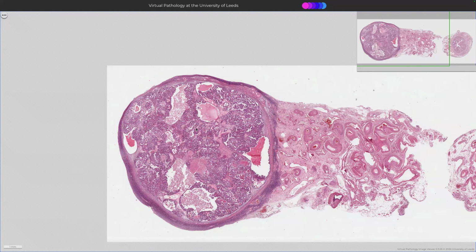The napsin A could be replaced by another one that begins with H that I've forgotten the name of, HBM something, but we could never get it to work in our lab, so we stuck with the napsin A. The napsin A, yeah, thank you, HNF1B. Thank you, Janetta. You probably have more immunos than Waikato.